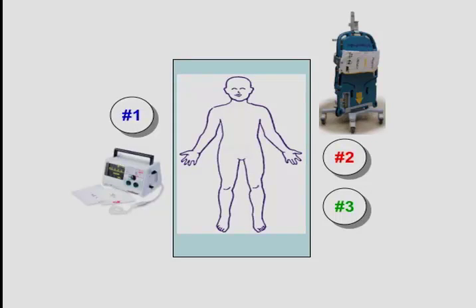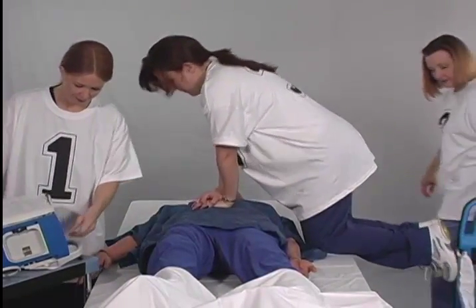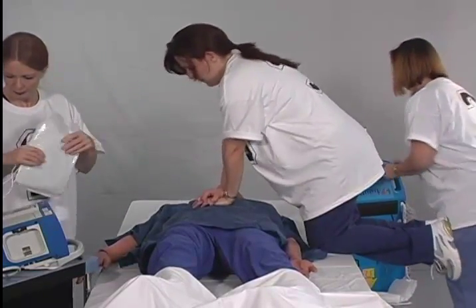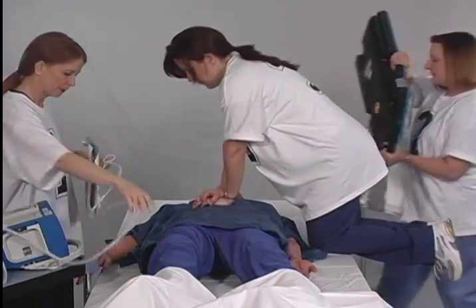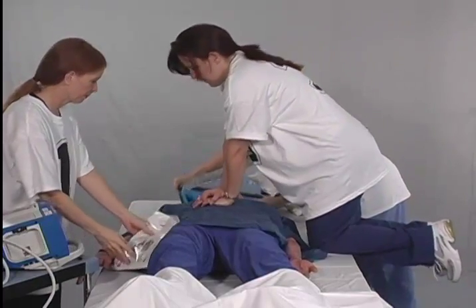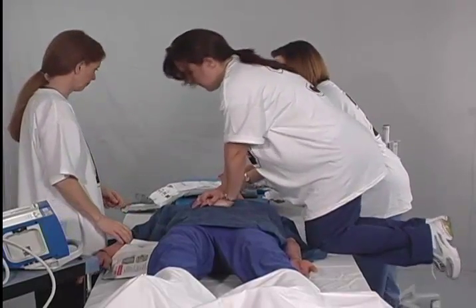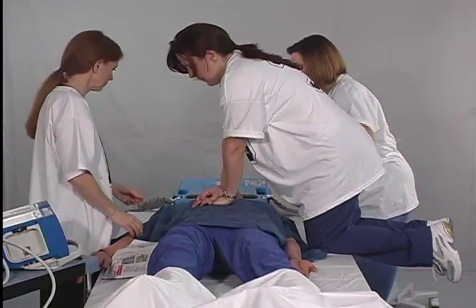Number three is also to the left of the patient and to the left of number two. Let's take a look at the process step by step. Staff member number two prepares the autopulse for use. He or she brings the autopulse in and places it on the left side of the patient and to the right of him or herself. Removes the autopulse from the transporter and lays it flat. Presses the on/off button at the top of the platform to power up the autopulse and places the platform at the head or left side of the patient with the lifeband open and out to the sides so that the platform is ready to quickly slide under the patient.